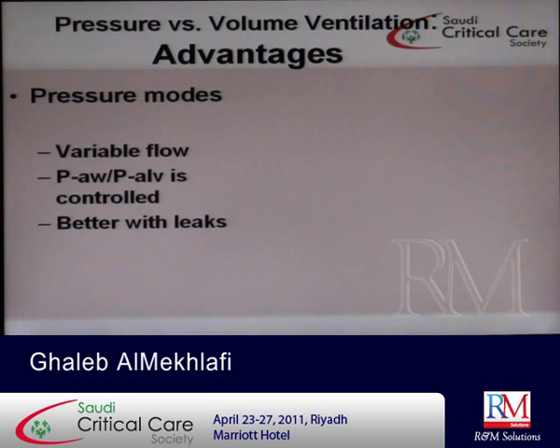Clear? Alright. So another advantage is that pressure modes are better with a leak. Why? Because the machine has to reach that pressure. So if there is a leak, it will continue giving more flow. So if there is a leak in the patient, pressure mode is preferred because it has to reach that level of pressure that you preset for the patient.